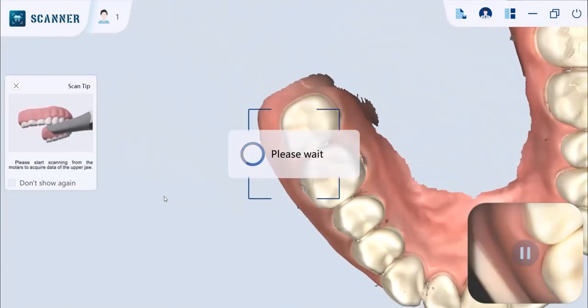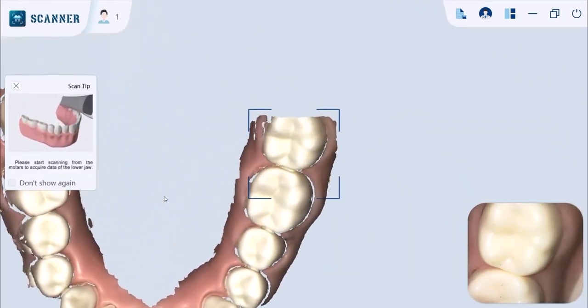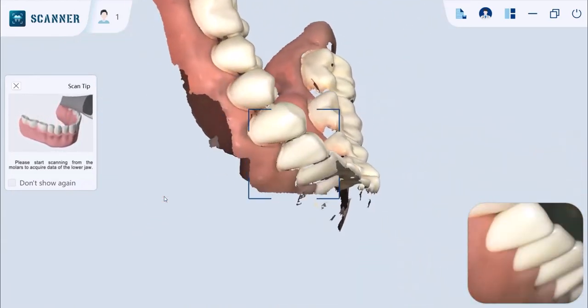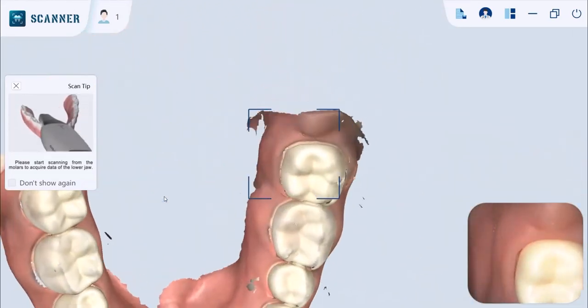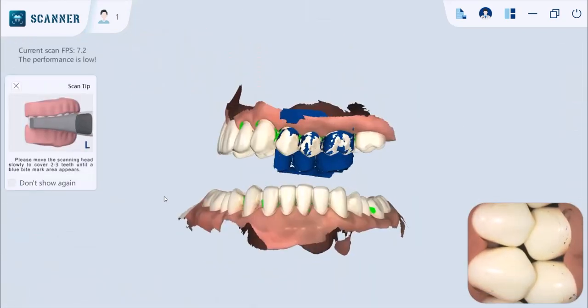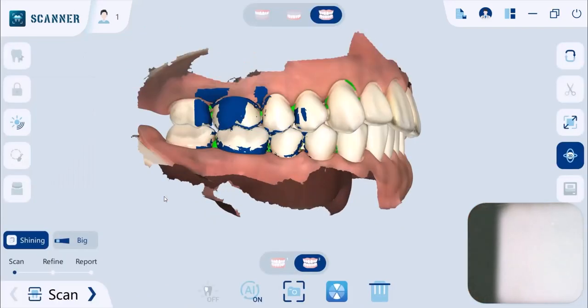After finishing the first arch, press the mode button to switch to the other arch. Then press it again to register the bite. Start by scanning the bite on one side, and once it's registered it will automatically allow you to scan the other side.